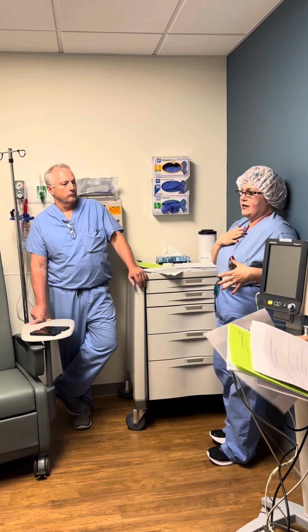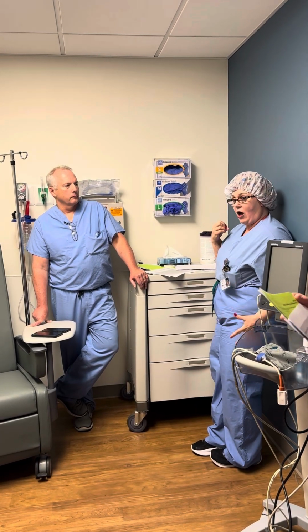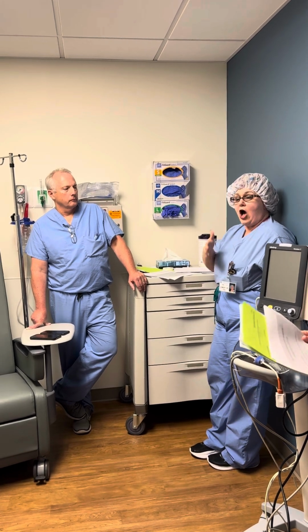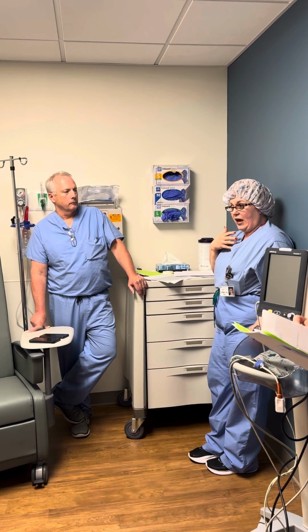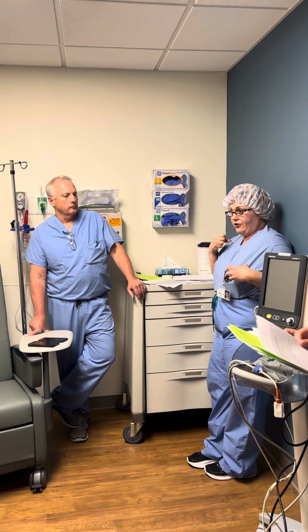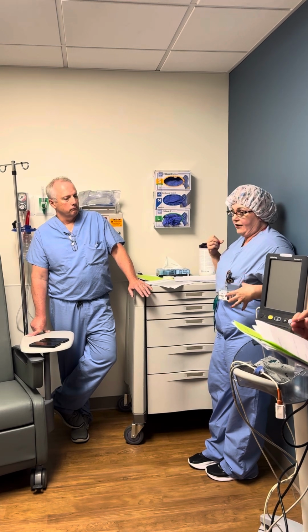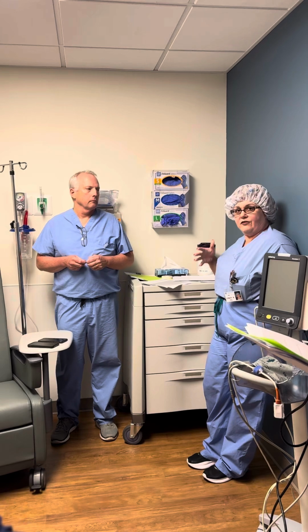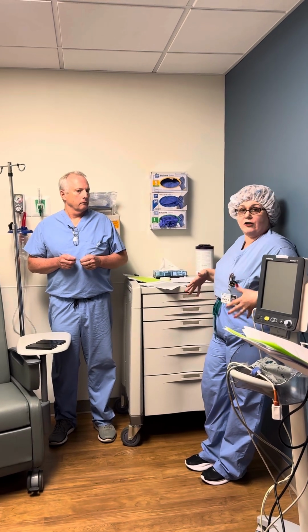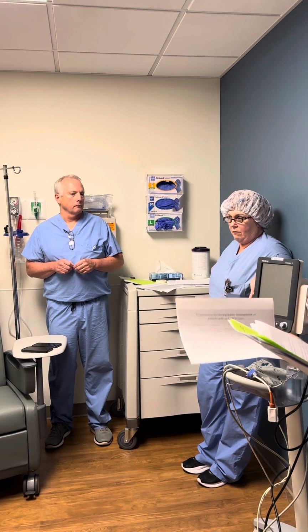The important thing is when you're putting a grounding pad for the cautery equipment, you're not crossing where that defibrillator is. Otherwise, the energy is going to be going through that device. So try to stay away from where that device is placed. If we can stay opposite but not too far away from the site, that's typically going to be ideal.